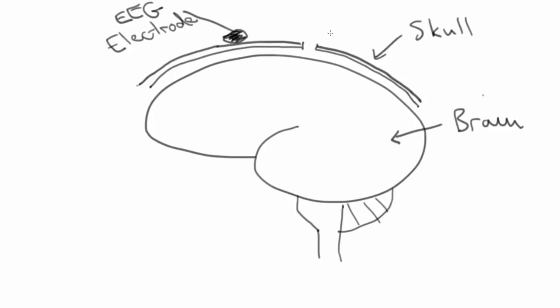Now I have put a break in the skull here. If we have an electrode adjacent to this region, higher frequency waveforms pass more easily through the breach in the skull than they do through the intact skull. So in the particular part of the head where there is a breach in the skull, you will have more prominent high-frequency activity, as we saw in the preceding example.